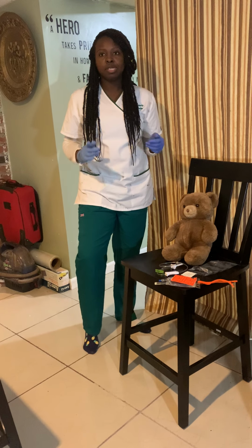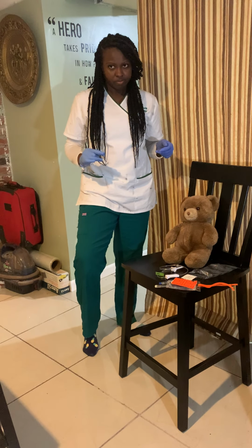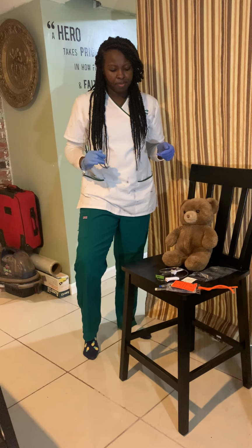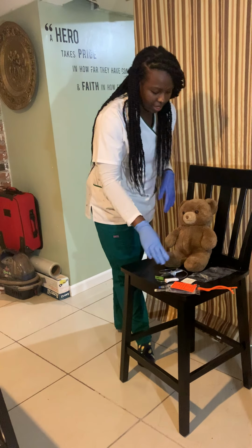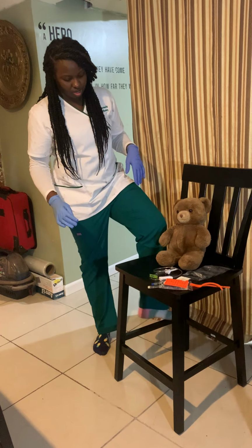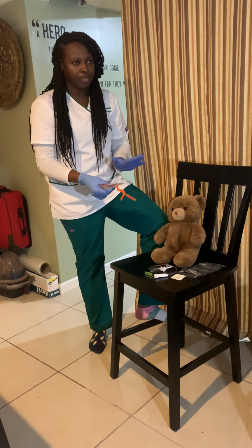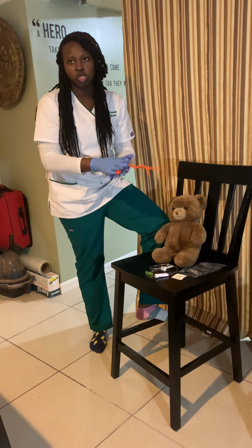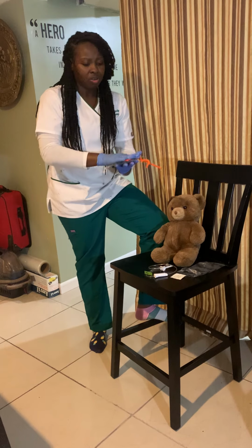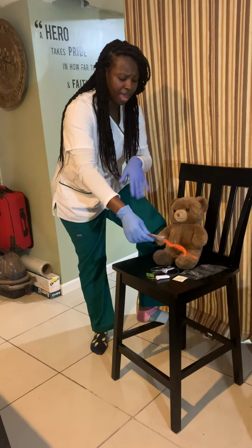So now I'm going to then remove the protective cover. I'm going to have the solution lie flat, which it is. And while I was in the medication room, I made sure it was distributed evenly, but I'm going to do it again just to make sure, and that it is all diluted into the piggyback.